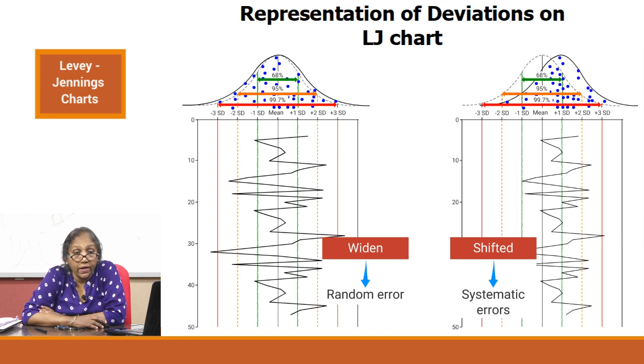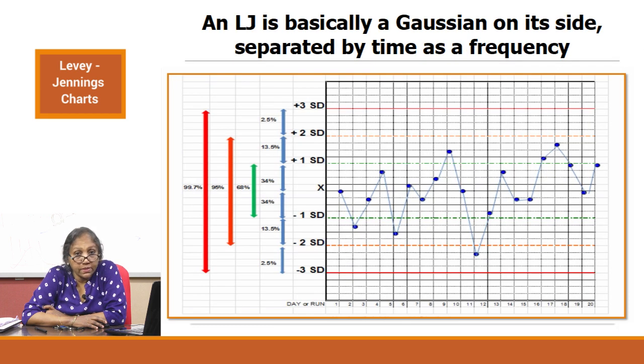It's not adequate if you say I have quality controls in my lab. It is not adequate to say I am making LJ charts in my lab. It is only adequate if you actually monitor and evaluate your LJ graph in a certain systematic way. Your frontline worker should be told what are the rules that he or she should be looking for, and the technical supervisory staff should make it a point to look at the graphs in a certain fixed periodic way.